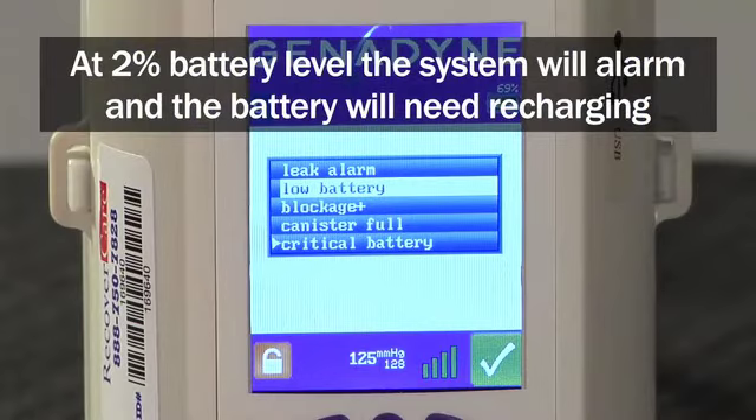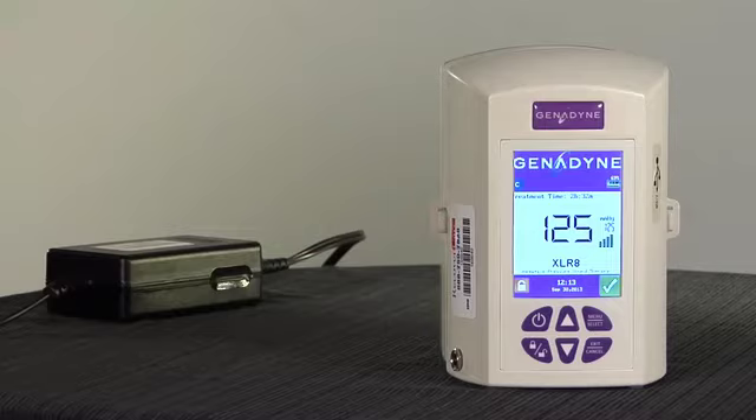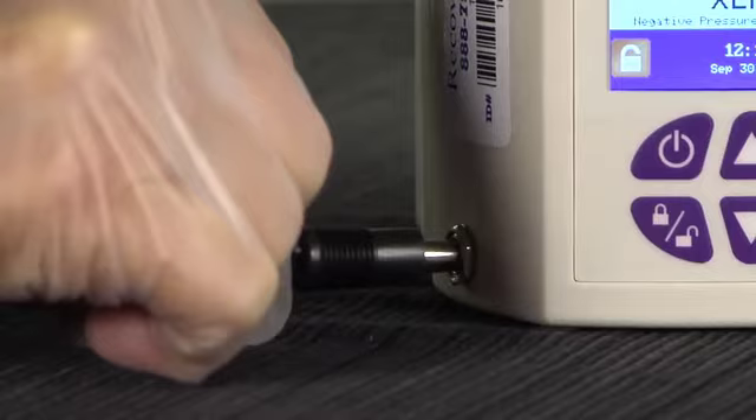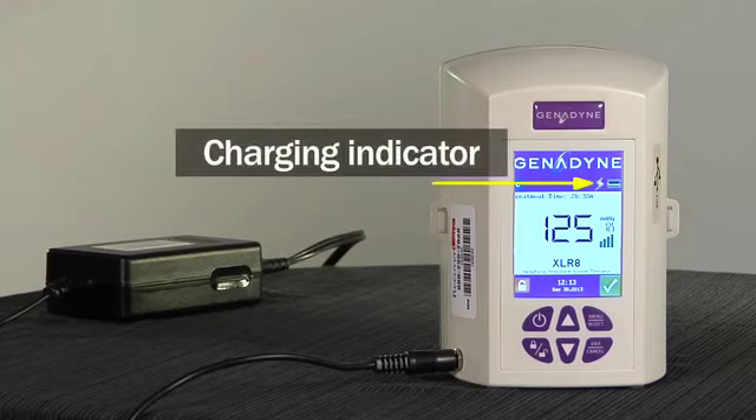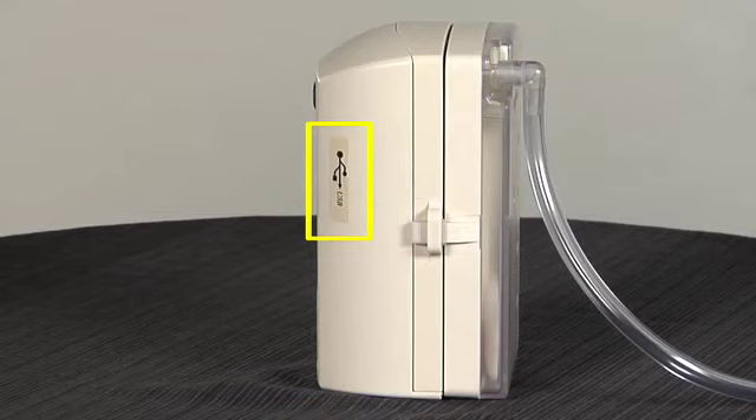When the battery reaches 2% life, the system will alarm. At this point, the battery typically has less than 30 minutes of life prior to the pump shutting down and should be plugged in to recharge. The Accelerate can be charged by plugging the AC adapter into the AC port on the pump and into a wall outlet. It is recommended to charge the unit when being used at the bedside to keep the device fully charged. The Accelerate takes only 3 hours to charge.